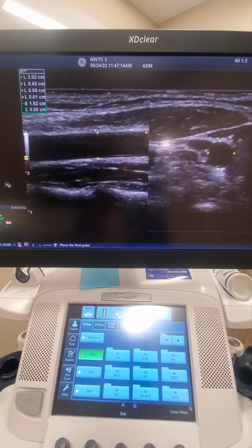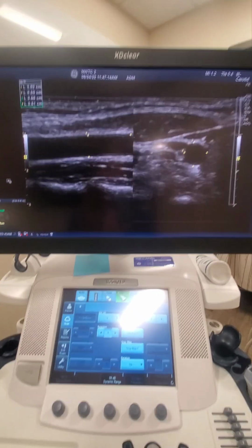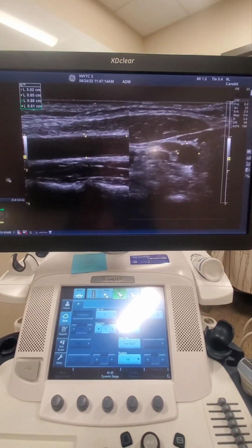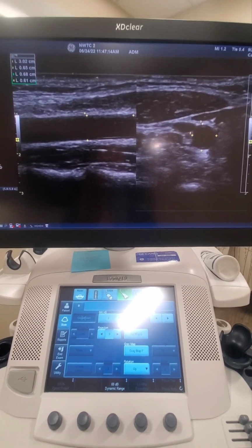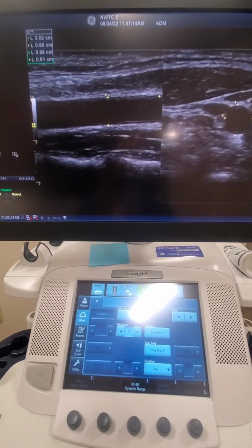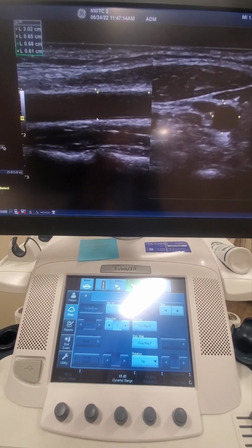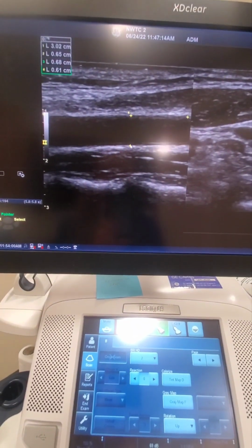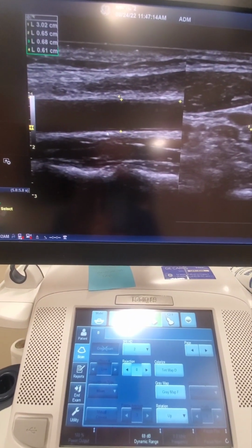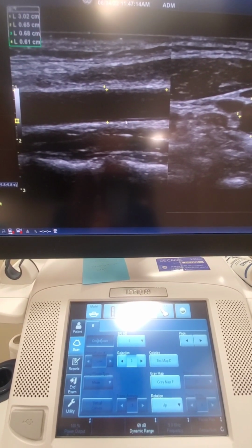How does that then correspond to our resolutions? What does resolve mean? Resolve means we can show 2 different structures exist in that area. Okay, we can resolve those 2 structures. We can show the existence of structures. I resolved down here really nicely that tunica intima and media.